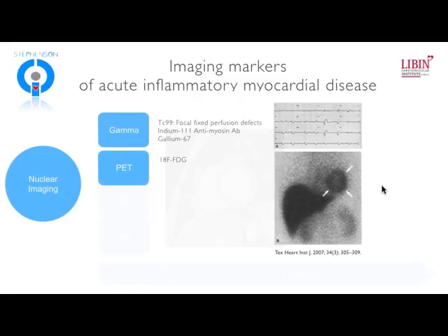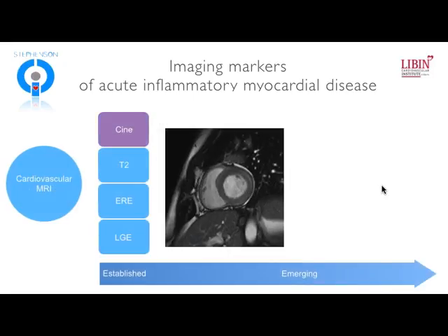But then really what evolved was trying to find something a little bit more specific to the myocardium. And so indium-labeled anti-myosin antibody imaging was tested for a period of time and had some clinical uptake within the late 90s and early 2000s. But because of lack of availability of that tracer and radiation exposure, it's really fallen off. And so really where we are today is some interest now re-emerging with PET imaging with FDG. And I'm going to come back to that a little bit later because we're going to talk about that when we talk about hybrid imaging with PET MRI.